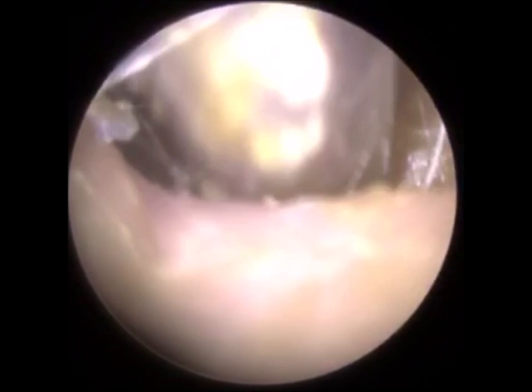So his original part of the ear canal is completely cleared now. That took me about 30 minutes to do, about half an hour. And now we're working on his mastoid cavity again. So again, it's just a lot of the same. I apologise, well, I don't apologise if anyone finds it boring. This is the reality of what I do. As I said, it's not as simple as some people believe it is, or sometimes I probably make out that it is in my videos.